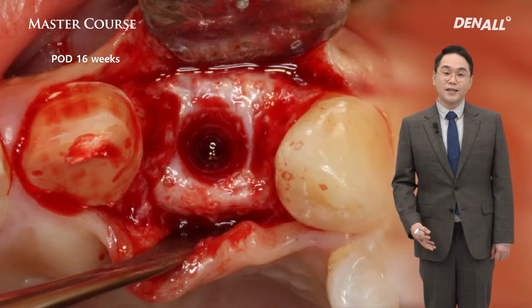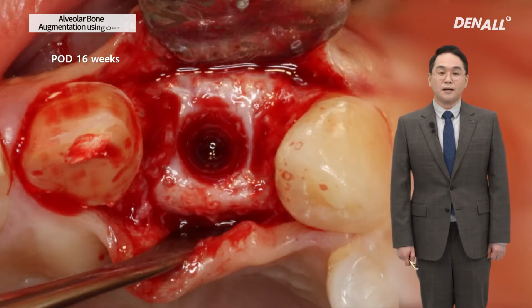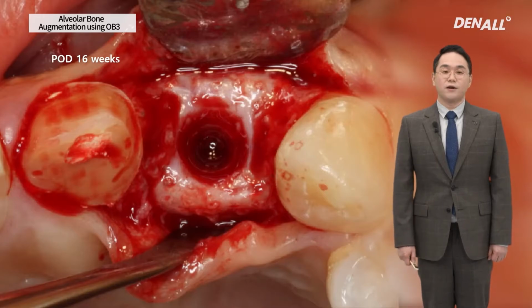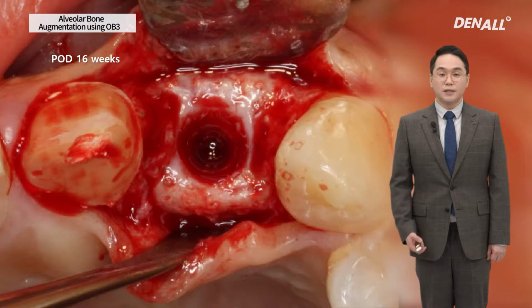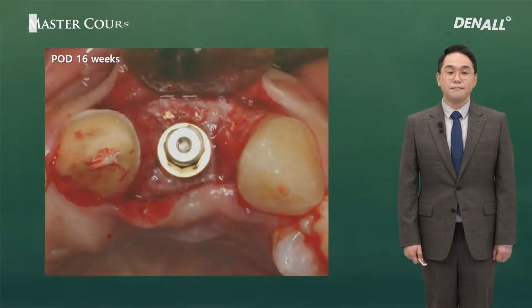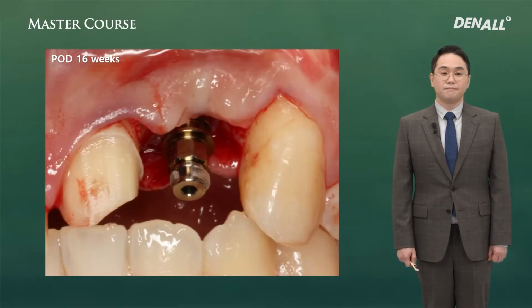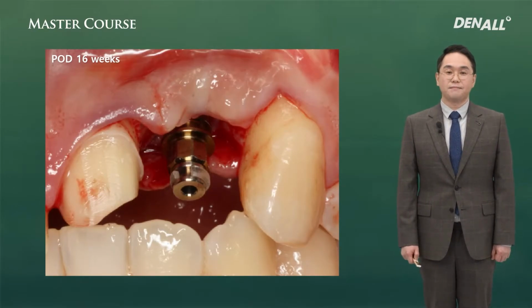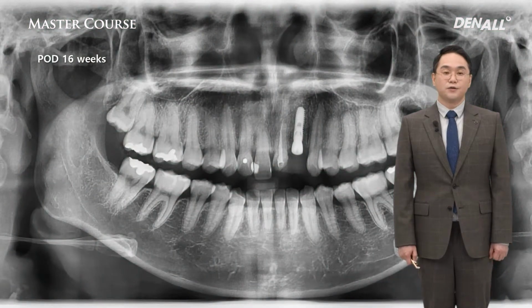The Jawbuilder is removed and the ideal bone is regenerated below. In the form of the Jawbuilder, the tenting screw can be easily removed as it has the machined surface. After removing the tenting screw, additional drilling is done to place an implant. The implant is placed. After the placement, you can see the implant path and angulation. The primary stability is very good, so the healing abutment was connected, completing the surgery.